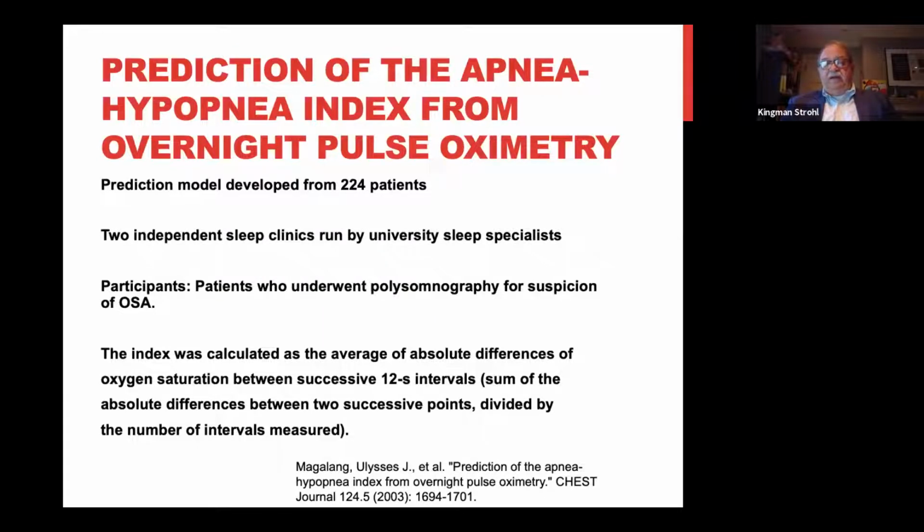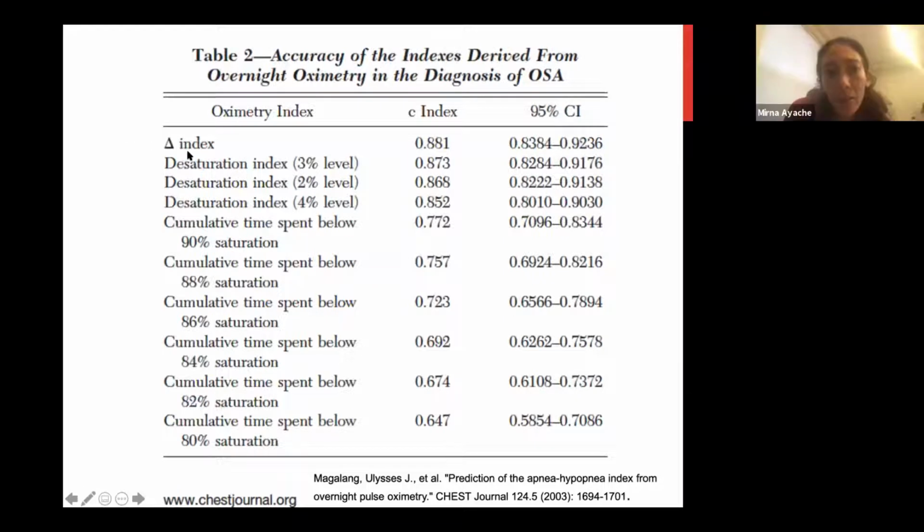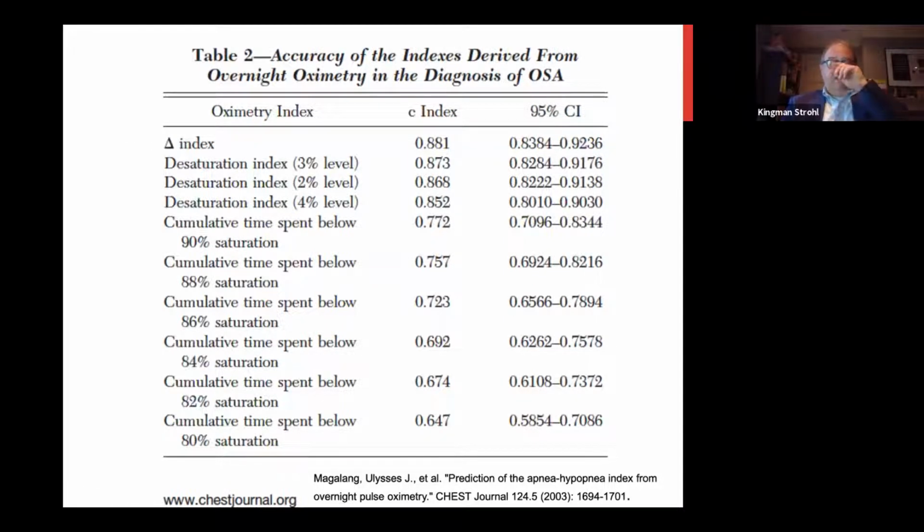Right, and then got a variability index of some sort. Right, so they called it a cumulative difference, which would be, if there was no difference over time, you would have this, and that would be their index. And then they used these other measures, some of which are going to be correlated, so they used some sort of model that they put together.